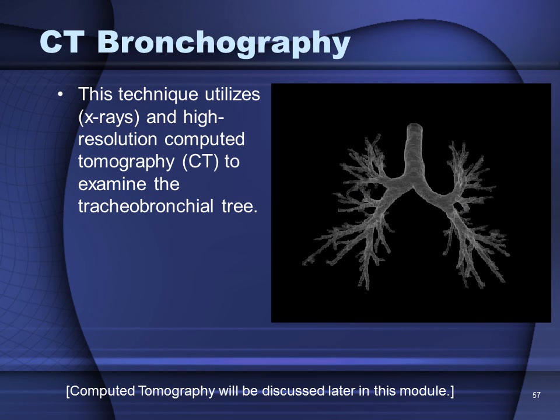Computed tomography bronchography is a technique that utilizes X-ray beams, but also high-resolution computed tomography to examine the tracheal bronchial tree. Detailed images of the trachea and all of the branches of the bronchial tree are produced using this technique.